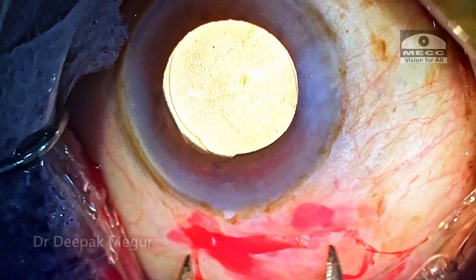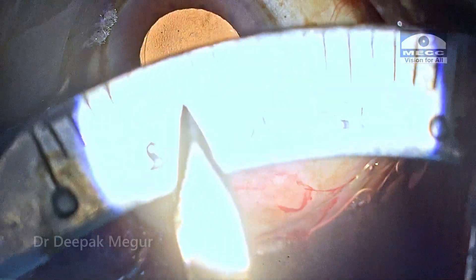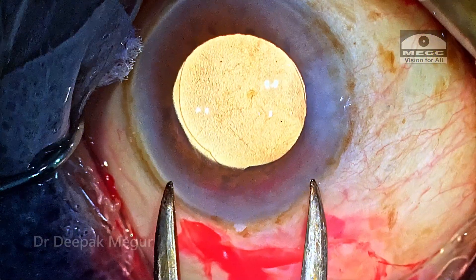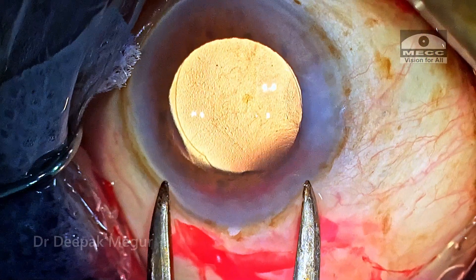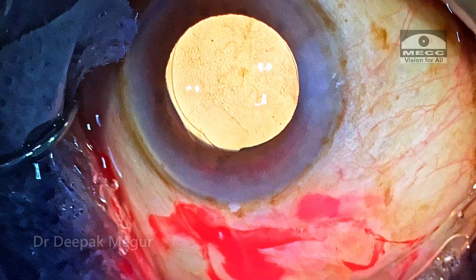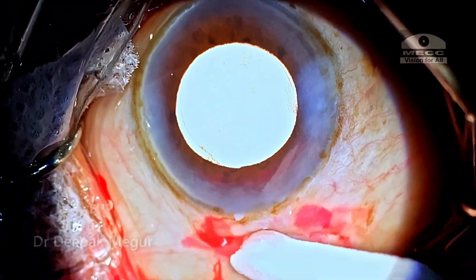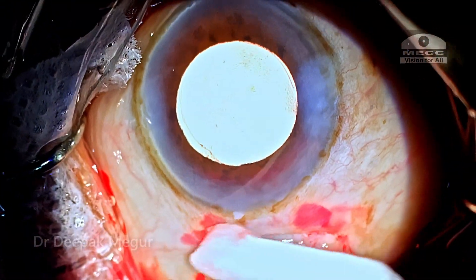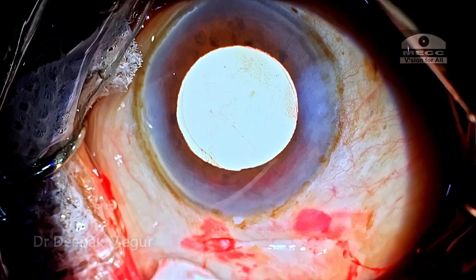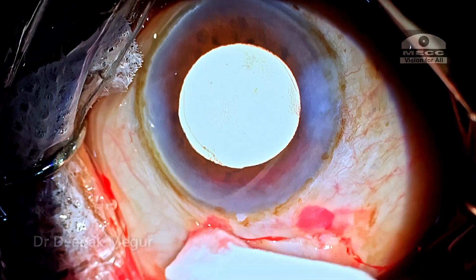The side ports are hydrated and that's it, the case is done. I'm just measuring the internal incision length — it's about 6.5 millimeters. Curious to know how much astigmatism this is going to induce. This is how the wound looks at the end of the surgery. I'm just trying to approximate the conjunctival edges towards each other.